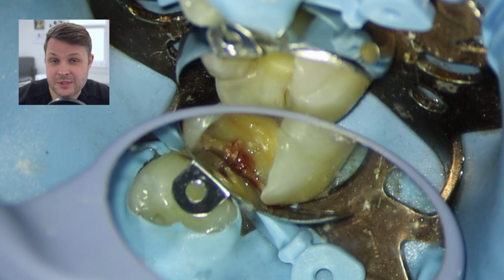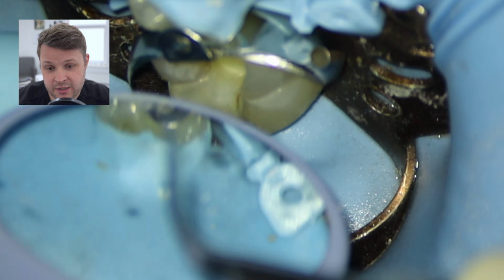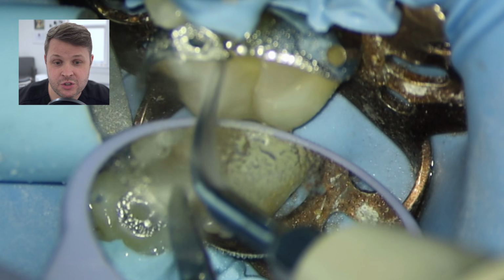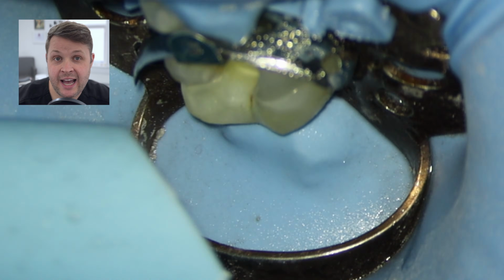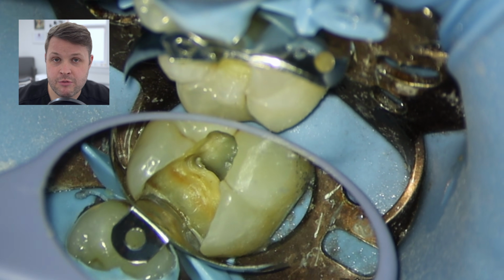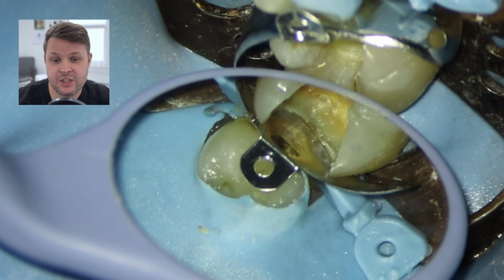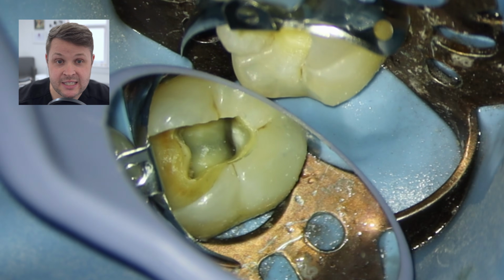And I always like to place a wedge prior, just to check to see if we've got a good margin. Here we've got a little bit of soft tissue which is trapped, and I'm just going to use a high energy ultrasonic just to remove this soft tissue. And sometimes this can just remove some of the soft tissue, and you can see now that there is a good tight margin between the matrix and the tooth.